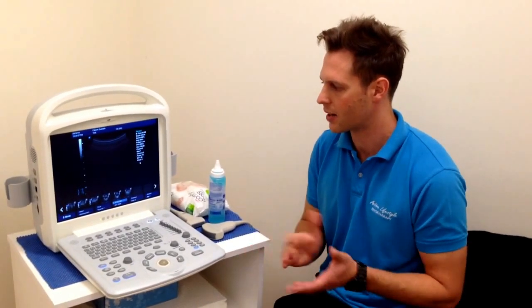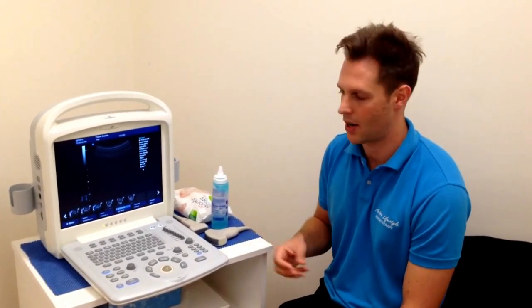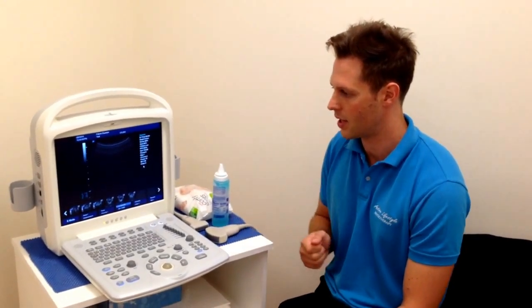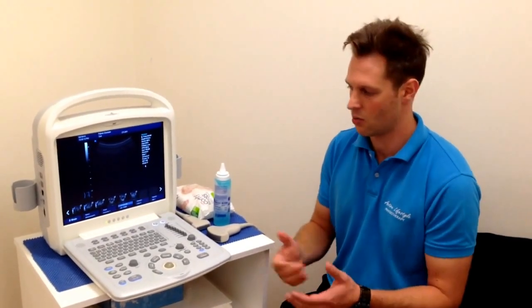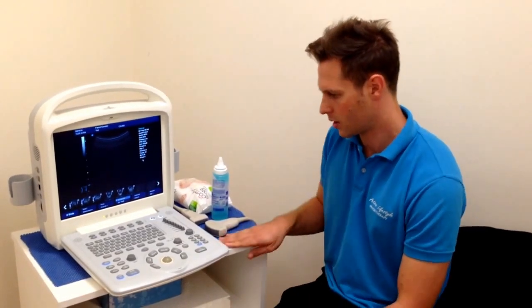Within the scope of practice of physiotherapy, we don't tend to use it for diagnosis of muscle tears or other types of pathology, but it is a good visual aid to help with our explanations to patients, to help with our explanation of treatment, and also to help in providing rehabilitative exercise and biofeedback for that.